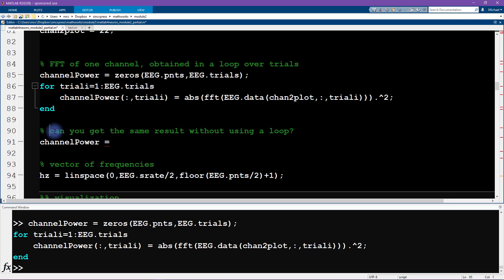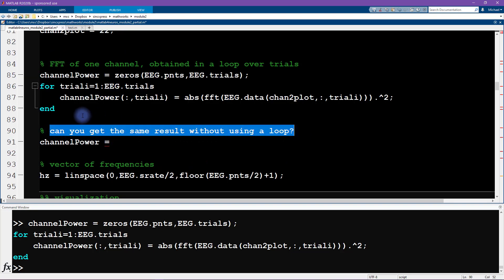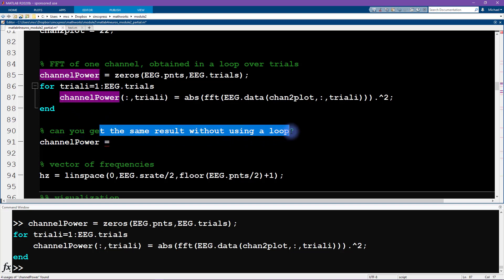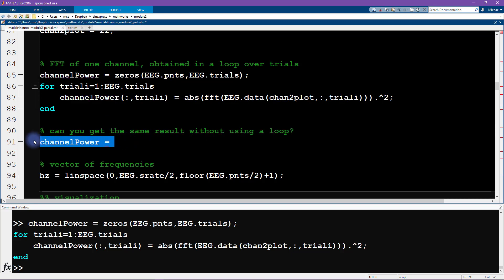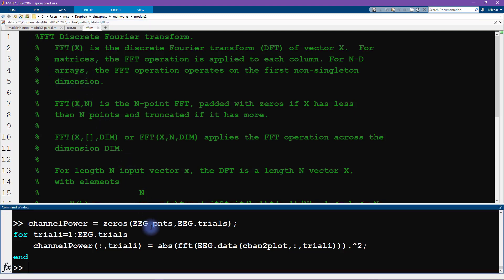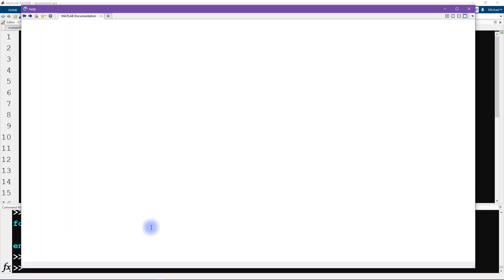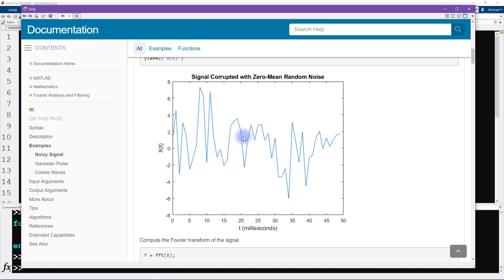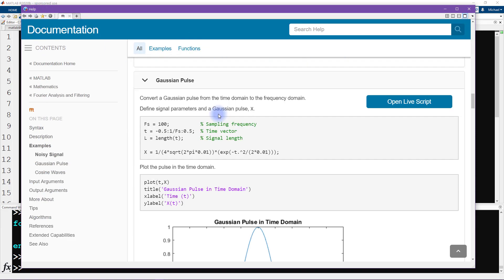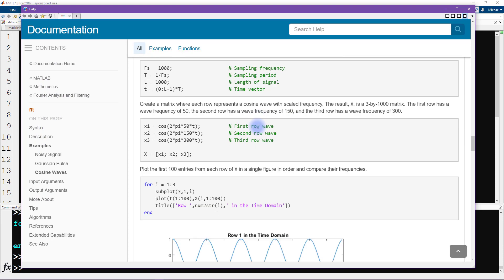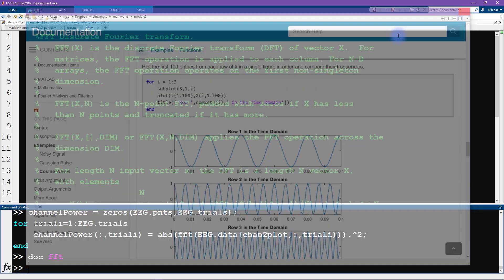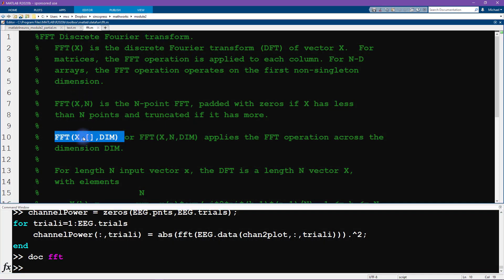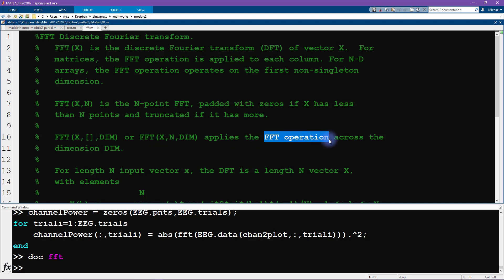Here's the question: can you get the same result without using a loop? So can we reproduce this matrix without using a for loop? Obviously, the answer is yes, otherwise I wouldn't have written this question. Let's open up the FFT function. We want FFT of x, empty, and then dim. This applies the FFT operation across the dimension dim. This is really convenient.